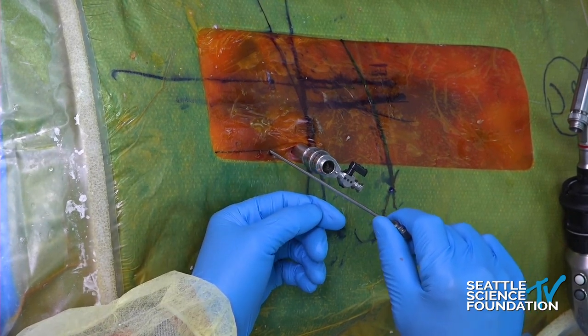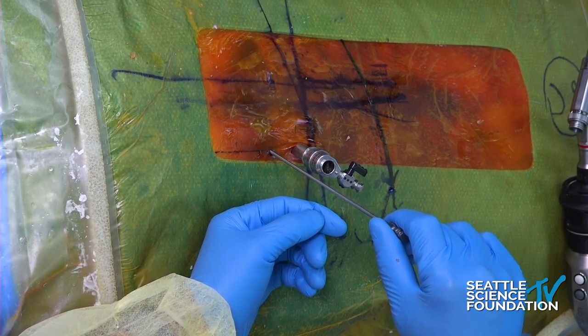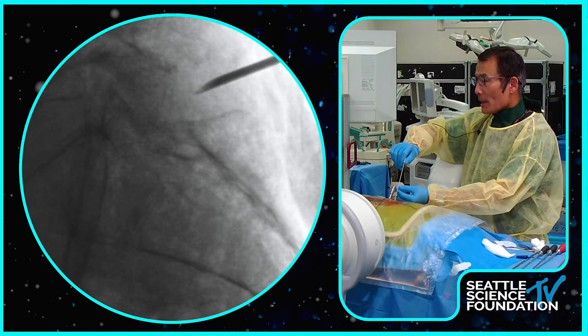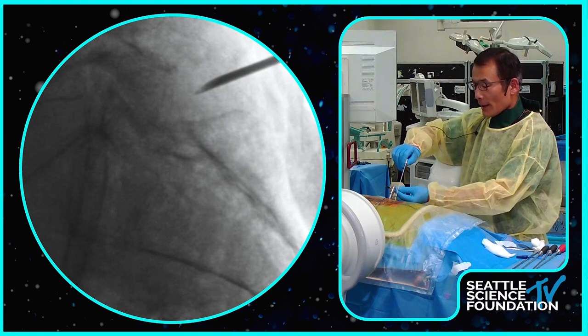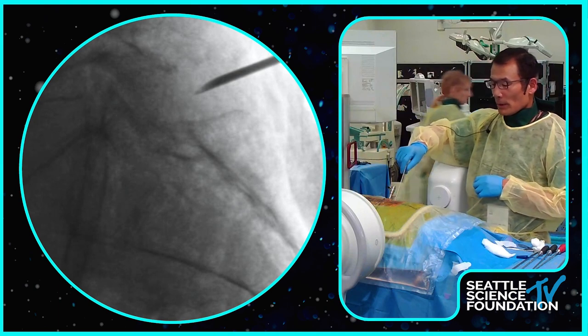I know if I choose my incision appropriately, just make a 1.5 centimeter incision, I can get into the disk space and put the cage there. And later on, after the cage placement, I use the same incision for the S1 screw. So that would be the approach.